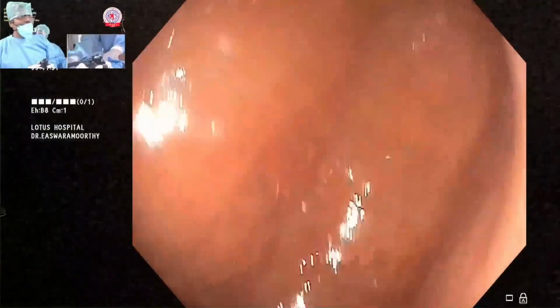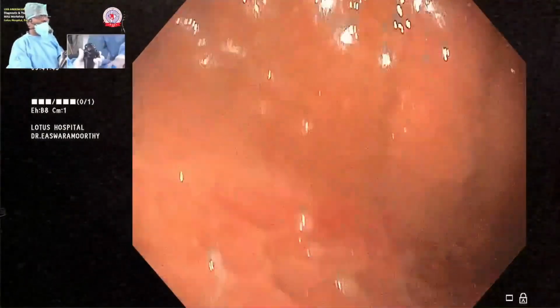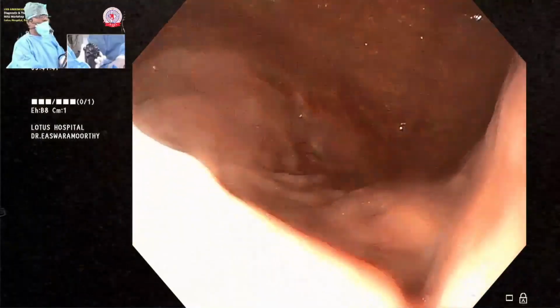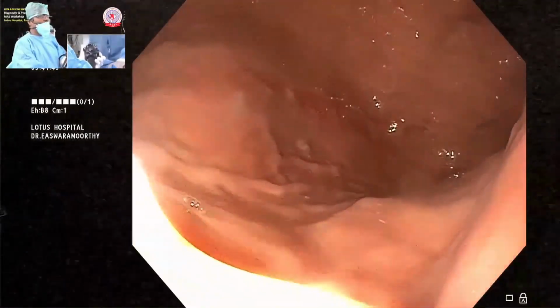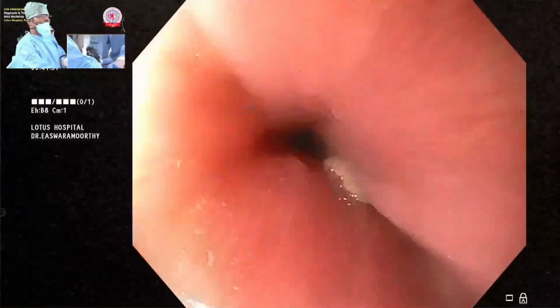The last thing you do is a deflate, then you come out. Deflate and depart. That's what I say. You deflate, then you come out. Otherwise, patient will go and burp outside. So I just deflate. So distensibility, linitis plastica can be excluded in some people by just seeing how elastic the stomach. Then come back, see the OG junction and have a good look.